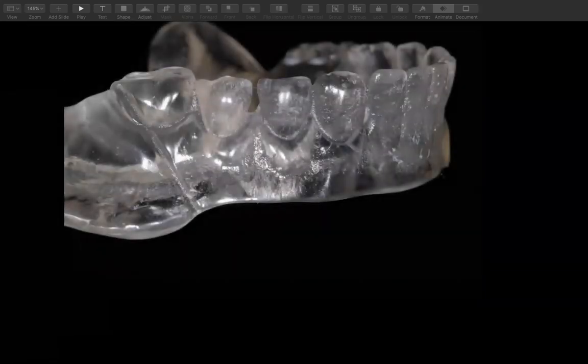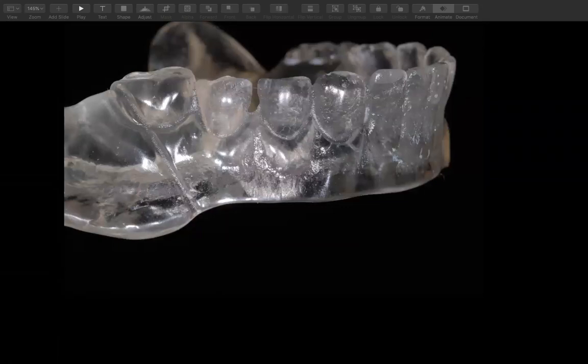So you can see in this picture that the flange has been cut from the incisal edge or occlusal plane to the edge of the flange toward the vestibular. I cut that at 15 millimeters. This gives the doctor or the surgeon a visual right away to put it in if they've reduced enough bone or not.